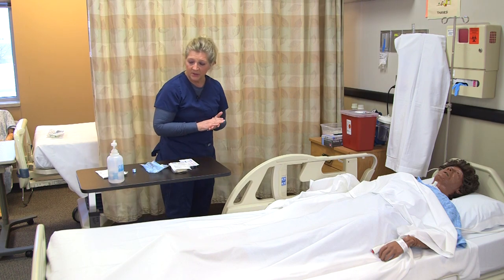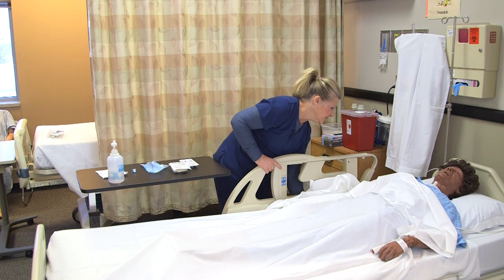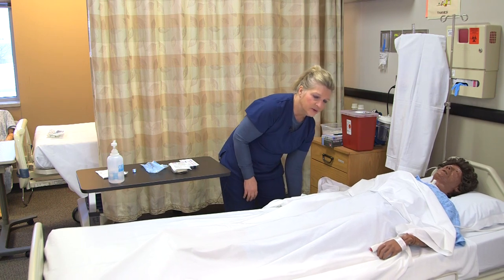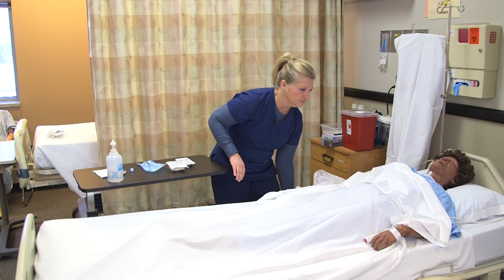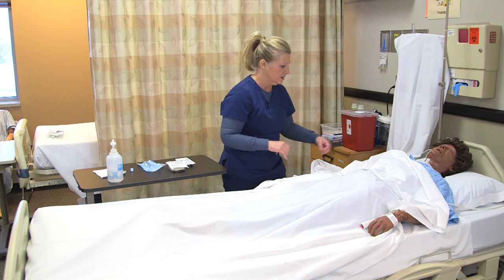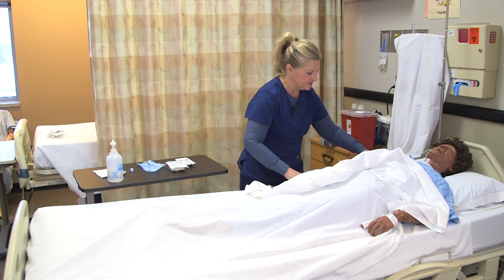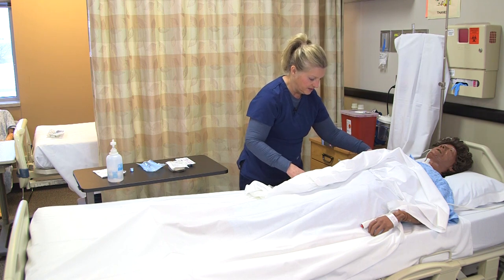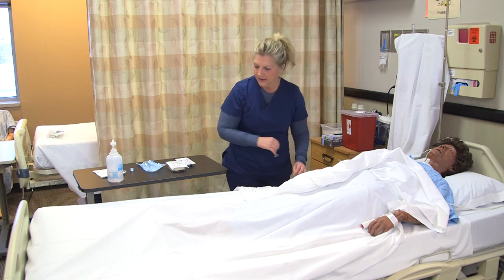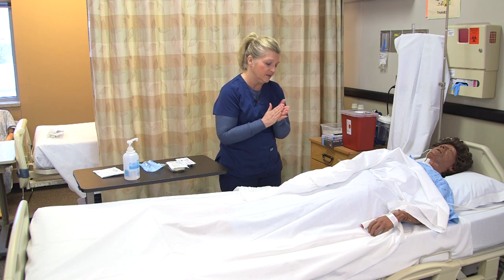Now that I'm in the room, I washed my hands as I entered. I check the identification, lower the side rail, and raise the bed to a working height. I explain to my patient what I'm going to be doing. The patient has no questions, verbalizes understanding, and denies any past history of having problems with IV starts.